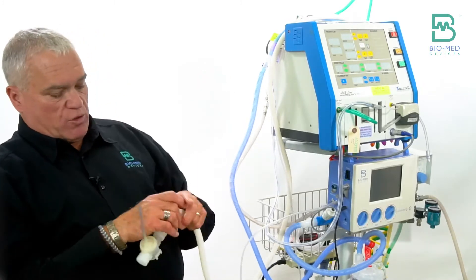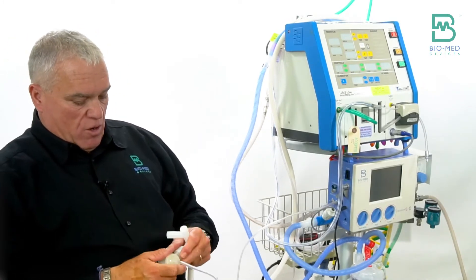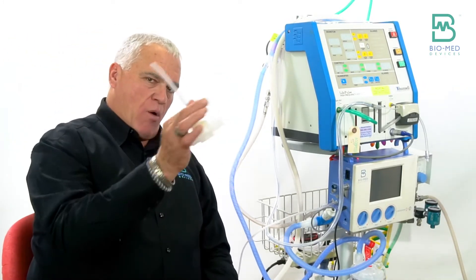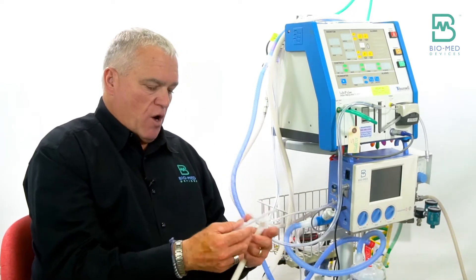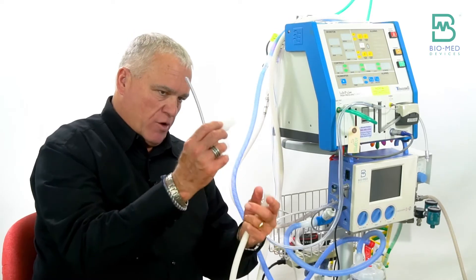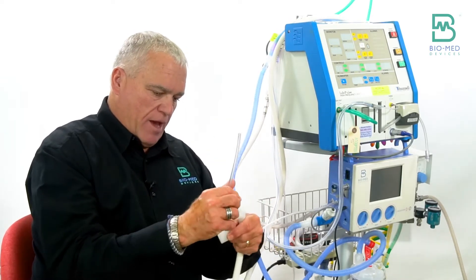Then at the expiratory limb of the circuit, what we're going to do is add our exhalation valves so that we can connect it to the Crossvent. That's where we need this other white adapter to make that connection.